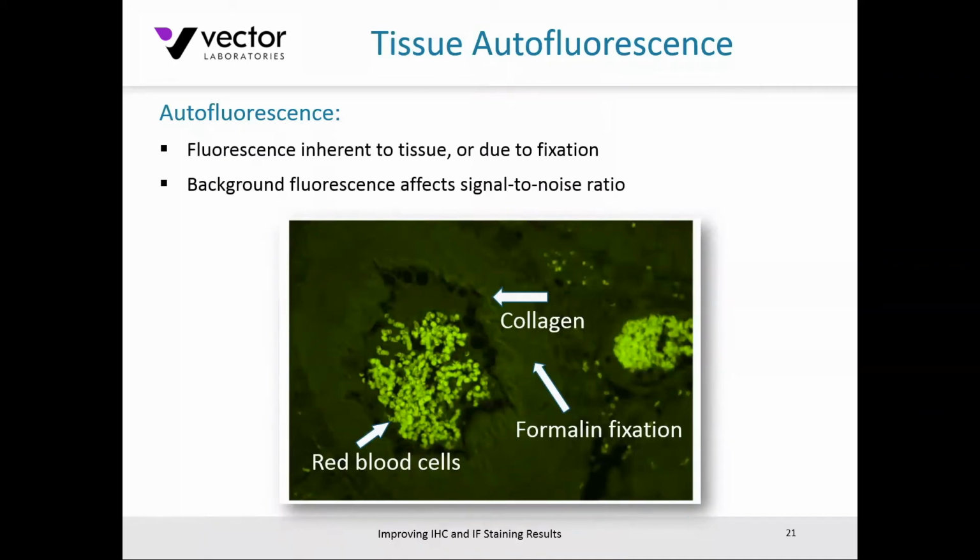It's fluorescence that is inherent or endogenous to their given preparation, that might be arising from a number of different cell types, or indeed tissue factors, collagens, elastins. Red blood cells are particularly notorious, or indeed due to things such as an aldehyde-based fixative. It can be induced through the use of a formalin, paraformaldehyde, or even a glutaraldehyde, for example. And you can imagine on this given slide here, in this green spectra, if you did have a fluorescein or a 488 conjugate, it really interferes with the signal you're looking for. But the confounding thing, of course, is if you think, I'm just going to go to a red fluorophore, well, unfortunately, tissue autofluorescence just doesn't stop at the green spectra. It's across the spectra, even into the far red. So there has to be some sort of methodology of quenching or blocking this tissue autofluorescence.